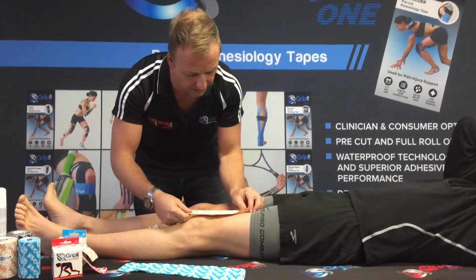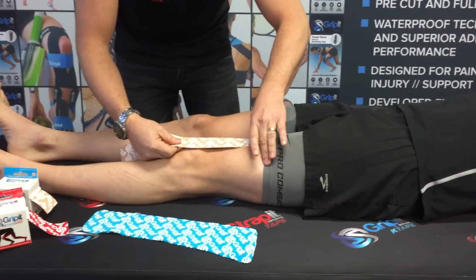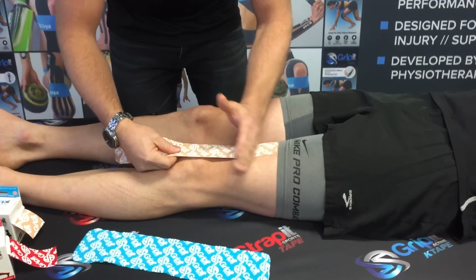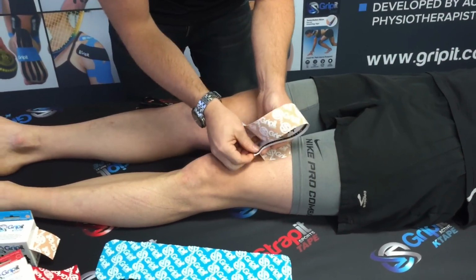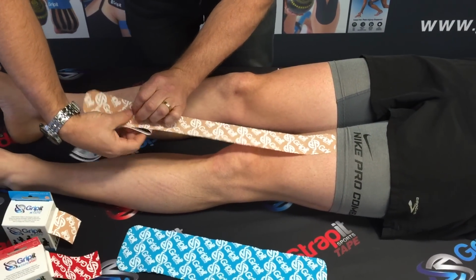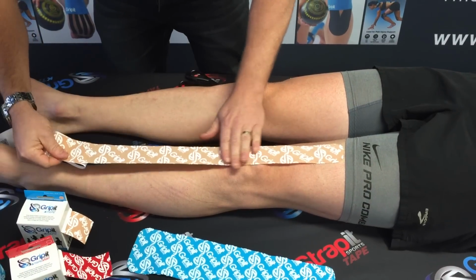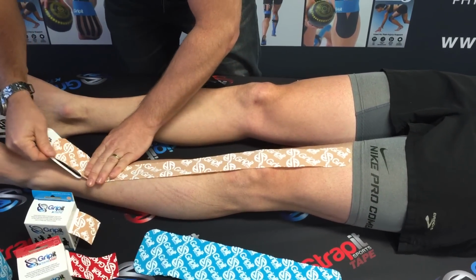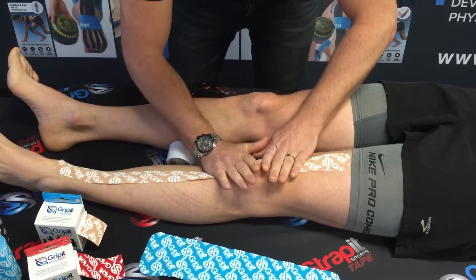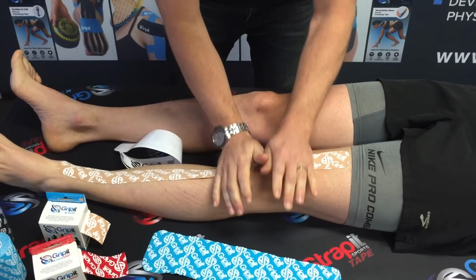Okay, so with our 5 centimeter strip, we can start around the mid area of the quadriceps muscle, but you can extend that if you wish to, if you really want to provide a very strong anchor point. Okay, so we have the anchor, and I like about a 2-inch anchor. And with the other end of the tape, we can stretch the tape. You can see that stretch there. And again, we're going all the way down today, so that's quite low, maybe a little bit lower than usual, but that's okay.